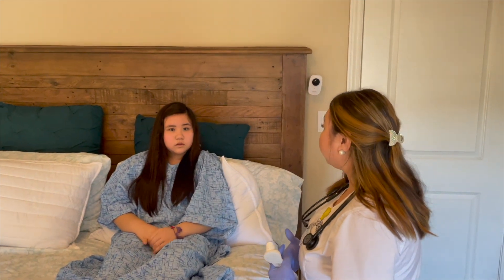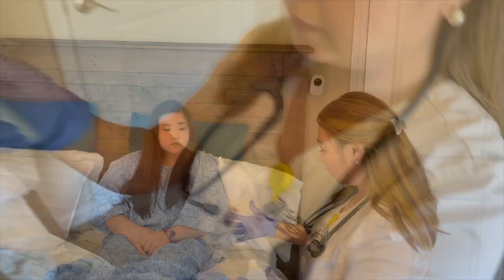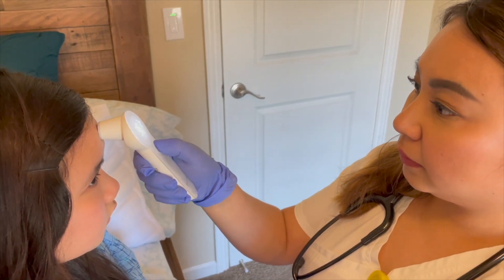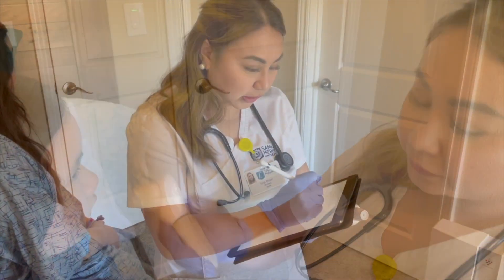Explain the procedure to the patient. Using a temporal thermometer, place it on the forehead and glide across the hairline. Wait for the reading and document the results.